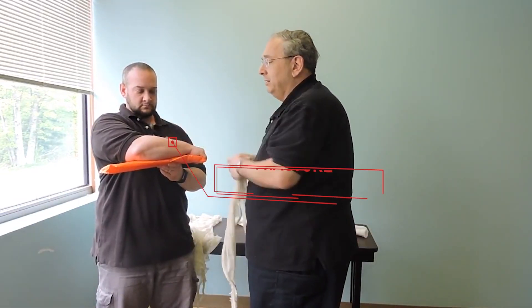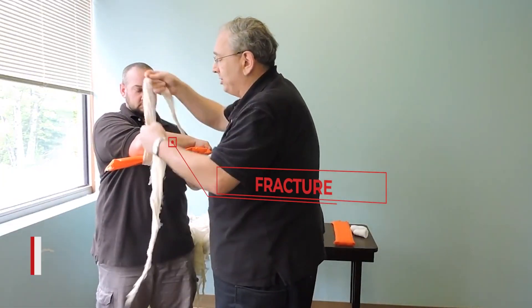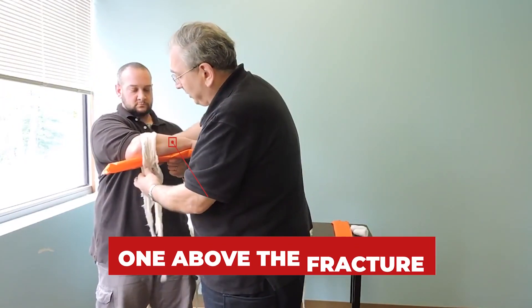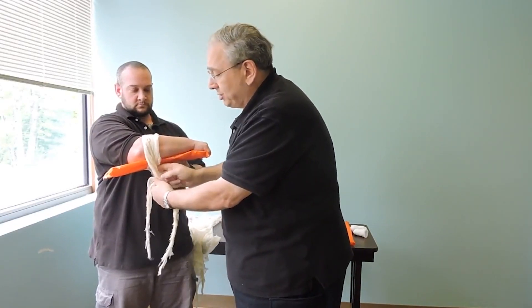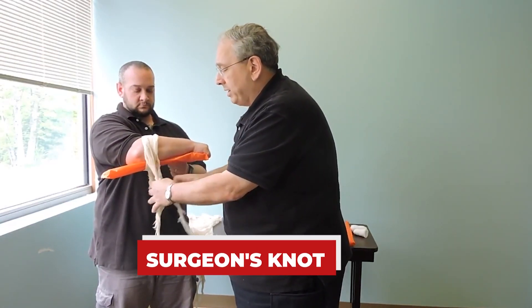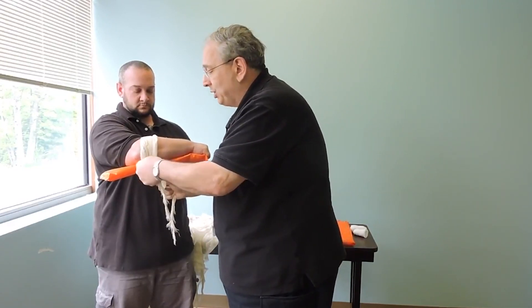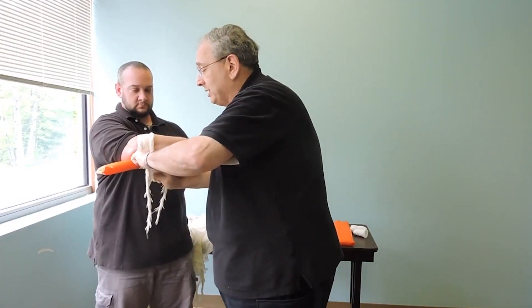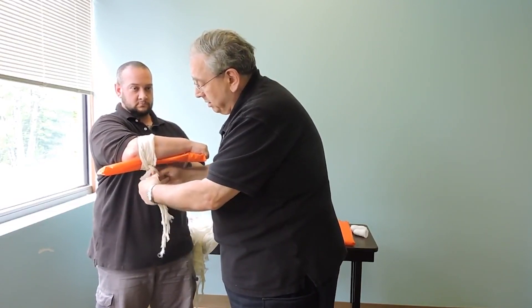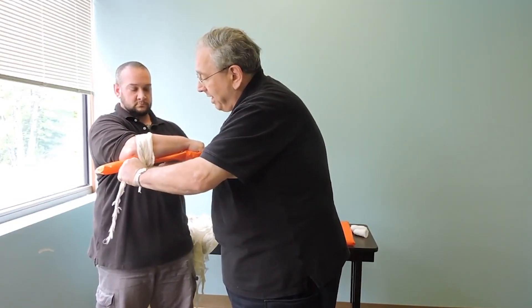The fracture is right here, so I want one cravat above the fracture. I'm going to loop it around once and then back through again and tie it with that surgeon's knot — go through once, go through a second time, and tie it against the board. I don't want to be tying knots against my patient. I want to make sure it's fairly tight and tie it a second time.